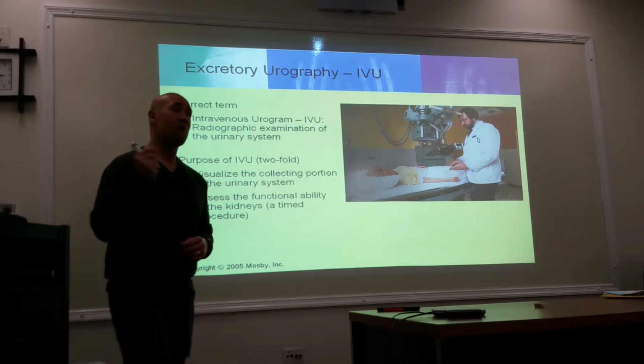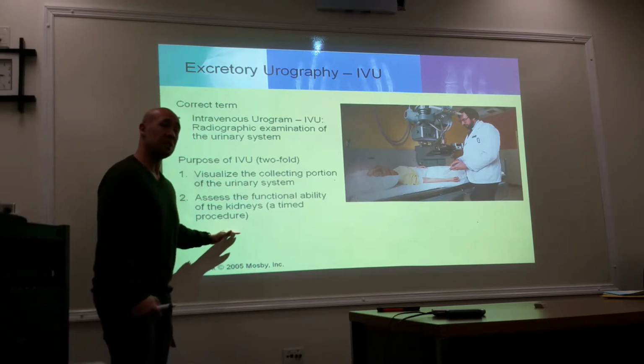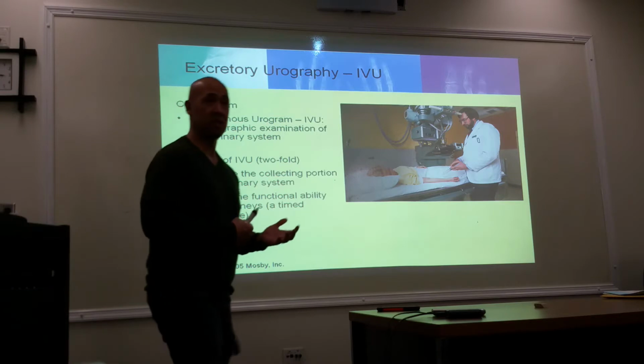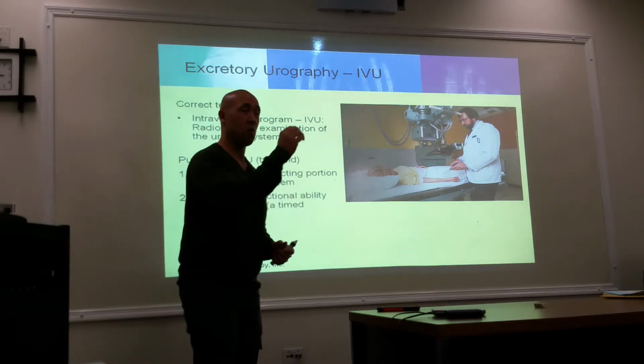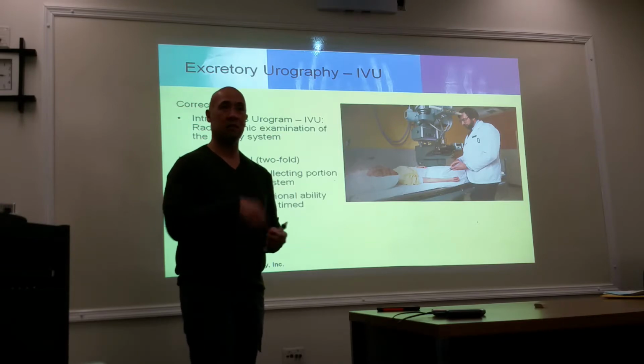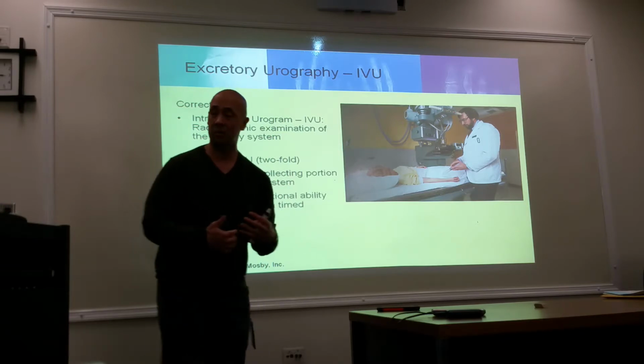Just like the small bowel follow-through, we also have timed images in an IVU. So you have to keep very close track of the time of injection, because that will determine what time to take those radiographs. And there's going to be a series of them, just like in the small bowel.